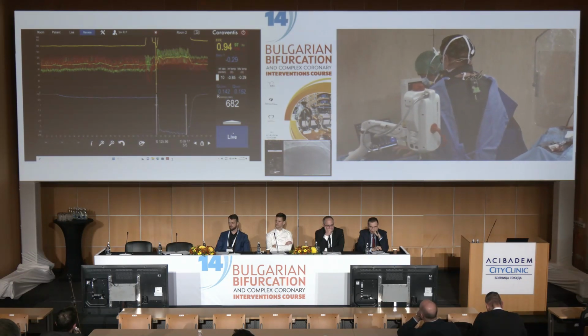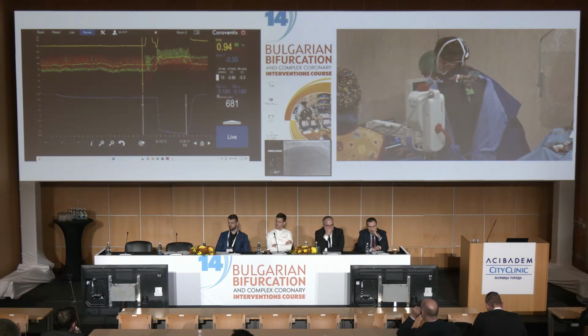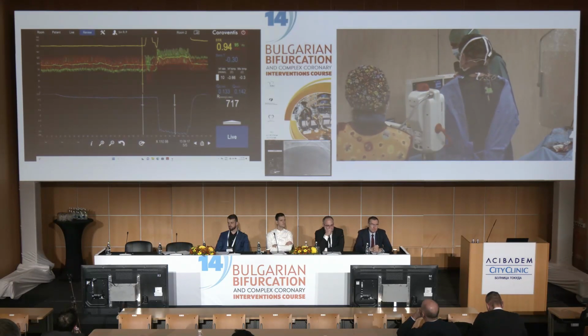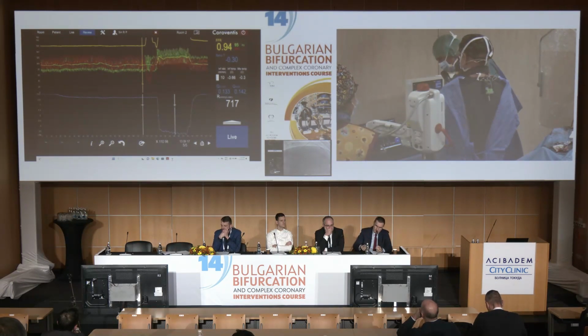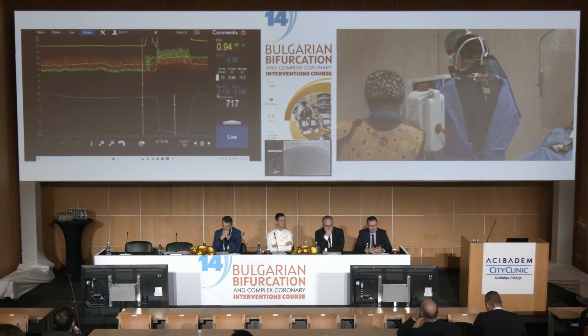And the only thing we have to do is to make sure that the measurements are not performed in a turbulent area, but in a very stable area, and we need all the elements to calculate absolute coronary flow at rest. And let's go to the screen. That is the temperature distal. Do we need this? Yes, for the calculations. But let's focus immediately on the results, because the calculations, the equations is difficult to do and to explain without the support of a slide.